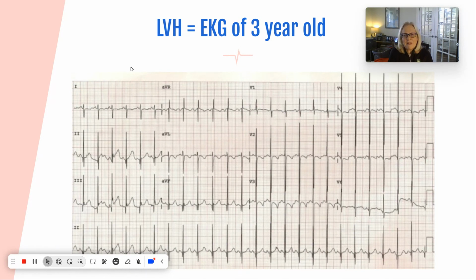So babies beat, I mean, that's normal for them to beat at 150 beats per minute, right? This is a 3-year-old. They're probably active though, because this is a 300, 150. This is like about 150 beats per minute. They were probably active running around the house, okay? But notice the QRS, how tall it is and how skinny it is.